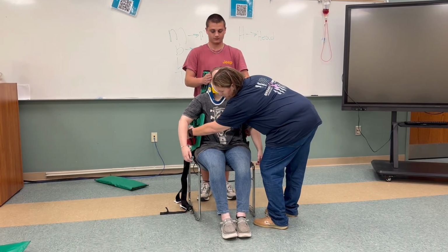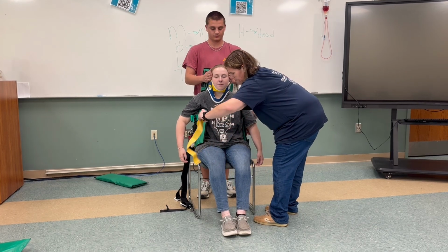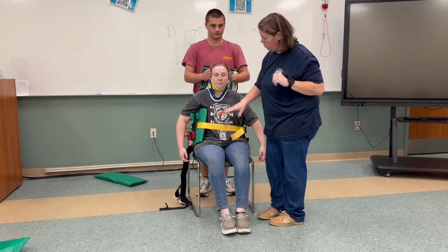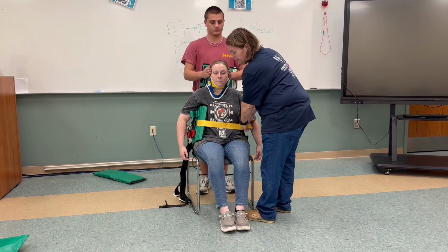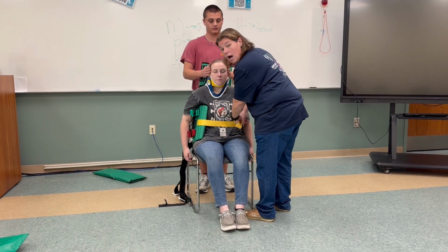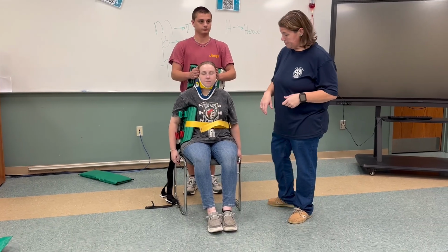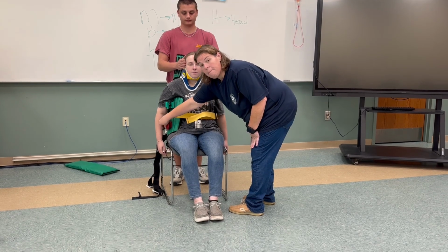All right. So my first one is going to be middle. My middle. So you'll take this strap and you will clip it right over in the yellow, because they're color coordinated. So this is yellow. The female portion of it is also yellow. Now this you need to make sure is super secure to your patient, because when you move them, you do not want it to move, because it could cause further damage to the patient if it's not secured properly and you go to move them. Now my B, middle, bottom, my baby.